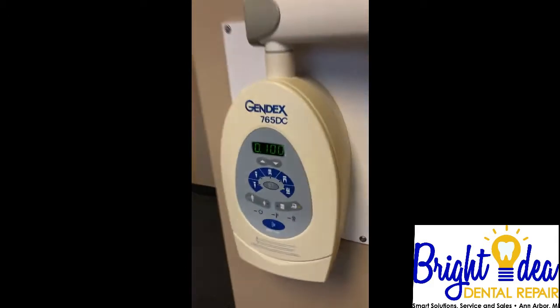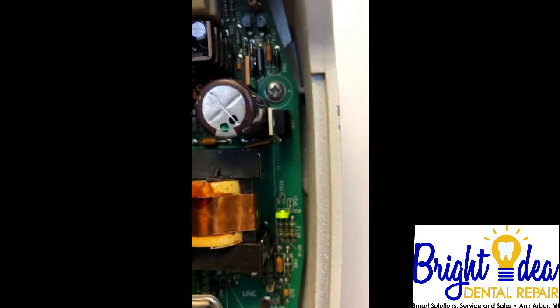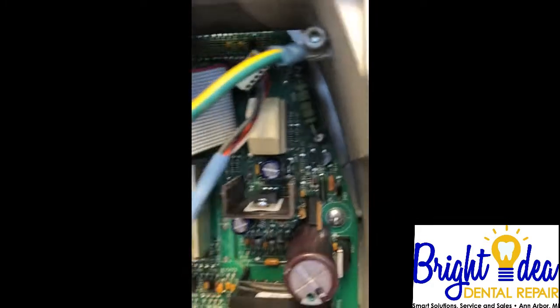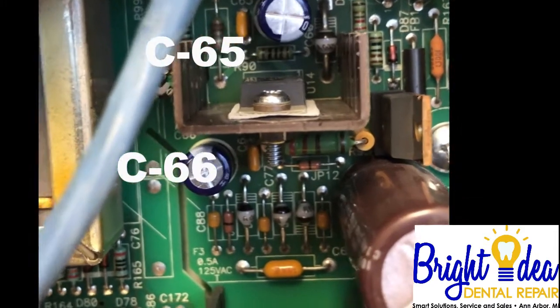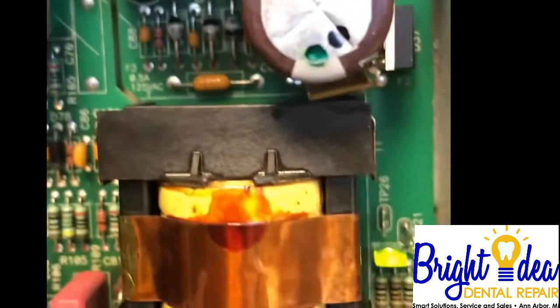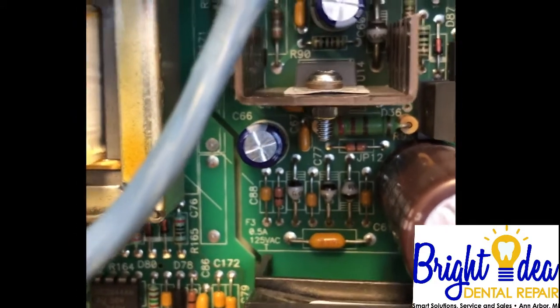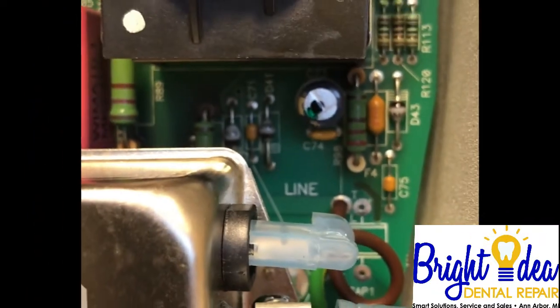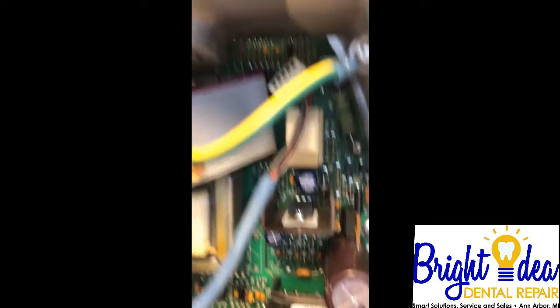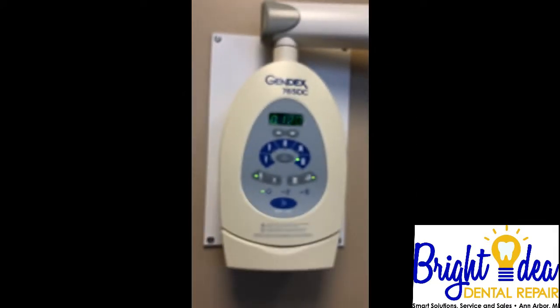Strong beat. Here's what I replaced: C60 right there — or is that C65? No, C60. And C65 and C66 right there. You can tell they're the two without any writing on them. All the other capacitors have some sort of writing on them, but those are the two I just replaced. That was the only thing I did.